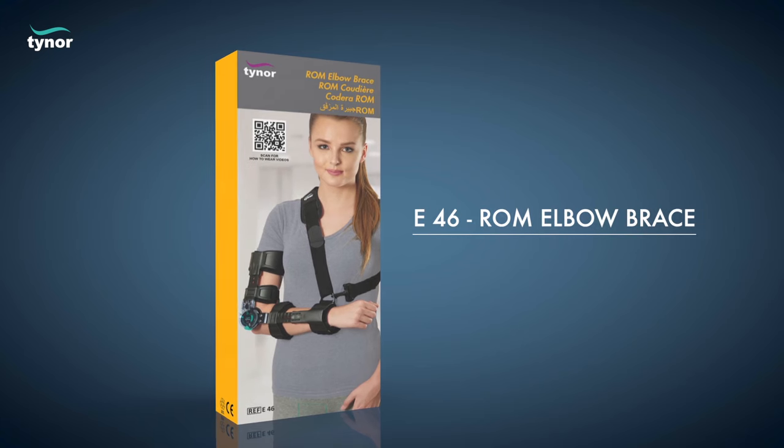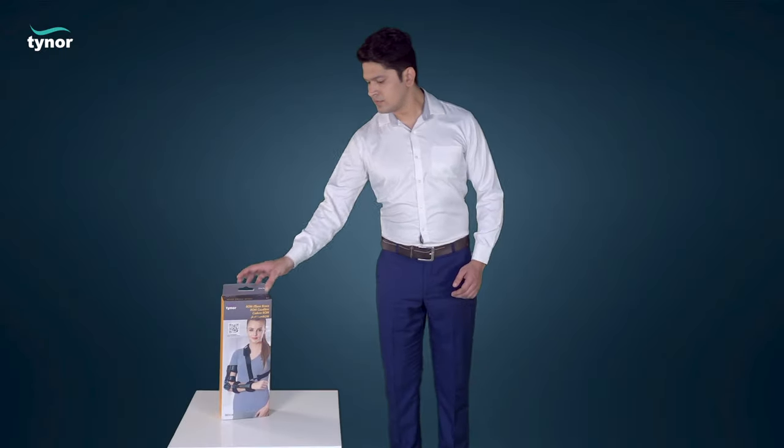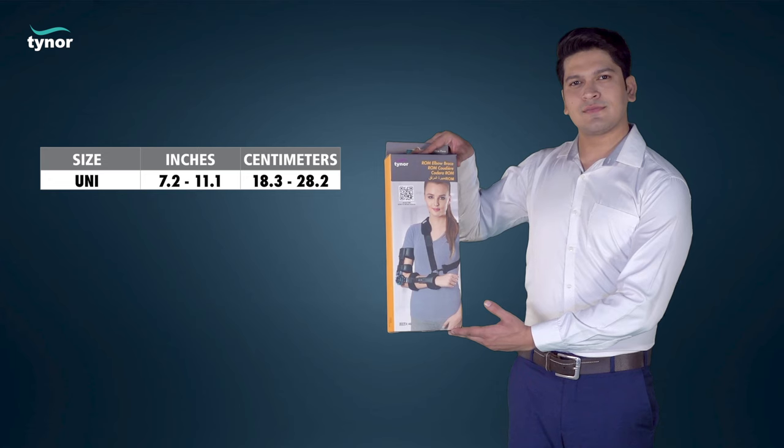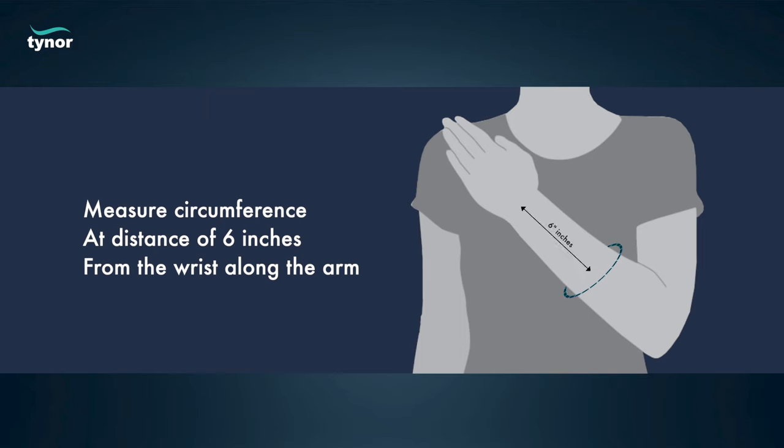Here we will discuss how to measure the size and how to wear the ROM elbow brace. The ROM elbow brace is available in these sizes. Measure the circumference at a distance of 6 inches from the wrist along the arm.